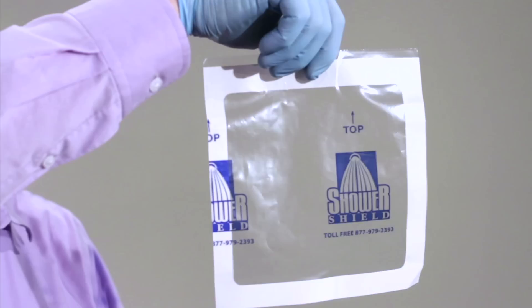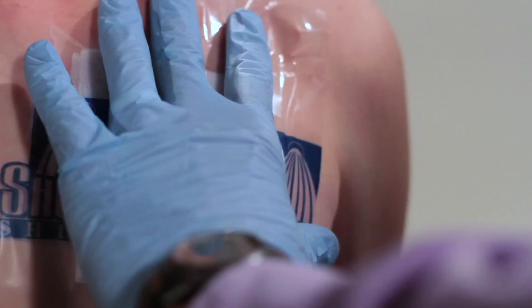It is latex free and transparent with adhesive just around the edges. This leaves a large non-stick surface in the middle, which keeps the dressing free from sticking to your sterile or clean dressing that you have already applied.